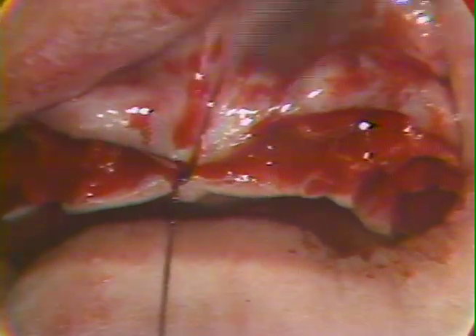That amounts generally then to suturing, for the most part, from the buccal and labial to the lingual and palatal, since most of the flaps for access are reflected from the buccal surface. We'll next proceed with a continuous locked suture distal to the last tooth and insert our first anchor suture. We can suction perhaps in the back of the pharynx slightly there.